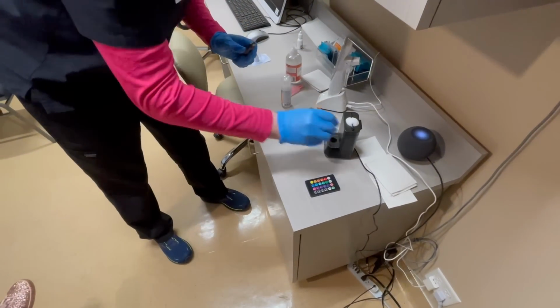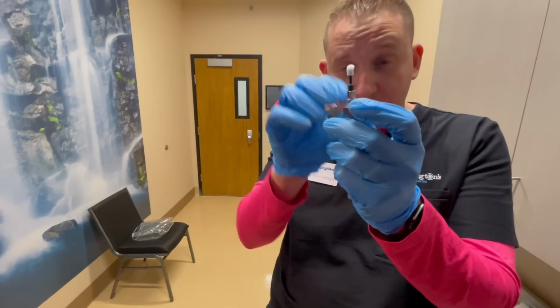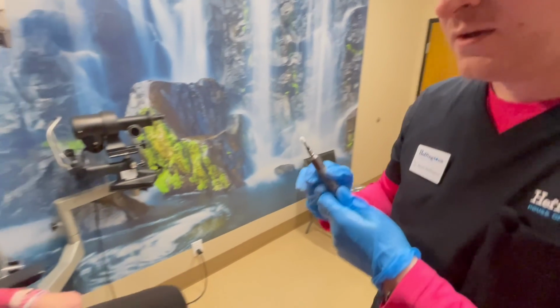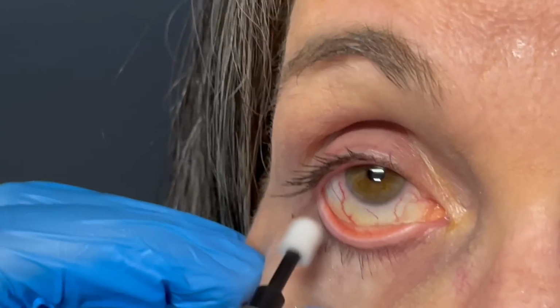So I'm going to step past you here, and we're going to get ready to do the first eye. We always start with the right eye usually. We put the little Q-tip looking device into the little BlephEx instrument right here. And we're just going to start with the right lower eyelid. Ask you to step over here for me, Mark. Thank you. Ready for this, Heather? Yeah. Okay. Lean your head back in the chair. Look up to the ceiling as high as you can go. And what's going to happen is I'm just going to be pressing this little button here. You just keep looking up for me.